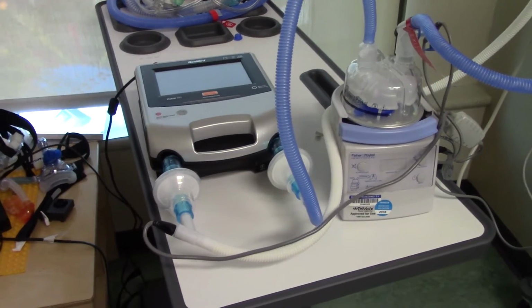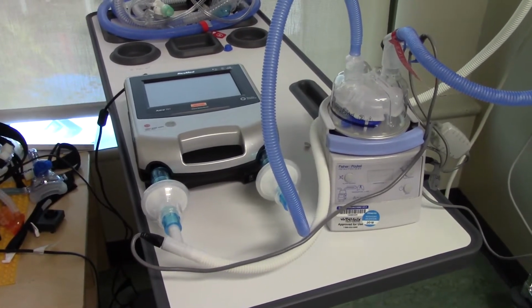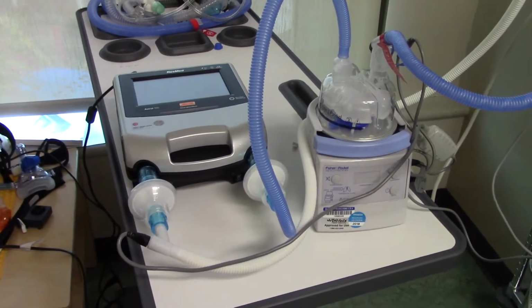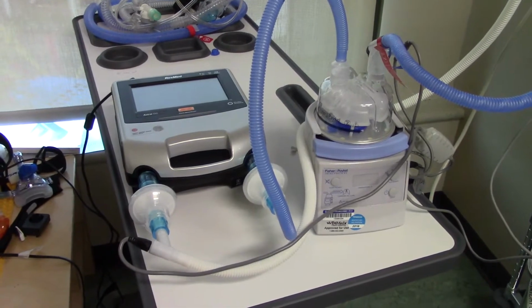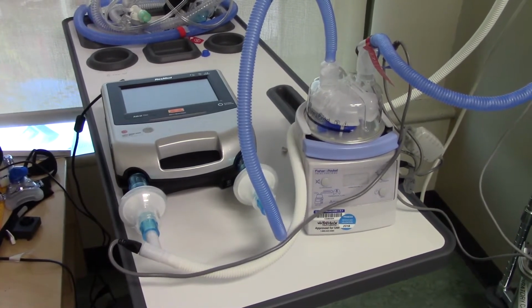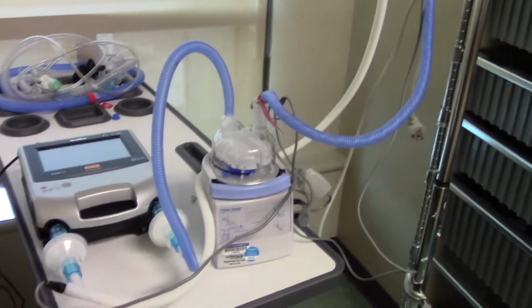And we know anytime you go from one vent to the next, it's not going to be the same. There's always going to be things that you can't change that are a little different, whether the bias flow or the actual resistance of the expiratory cassette, the injector modules. There's lots of things that change from vent to vent, but we're going to do our best to do it.